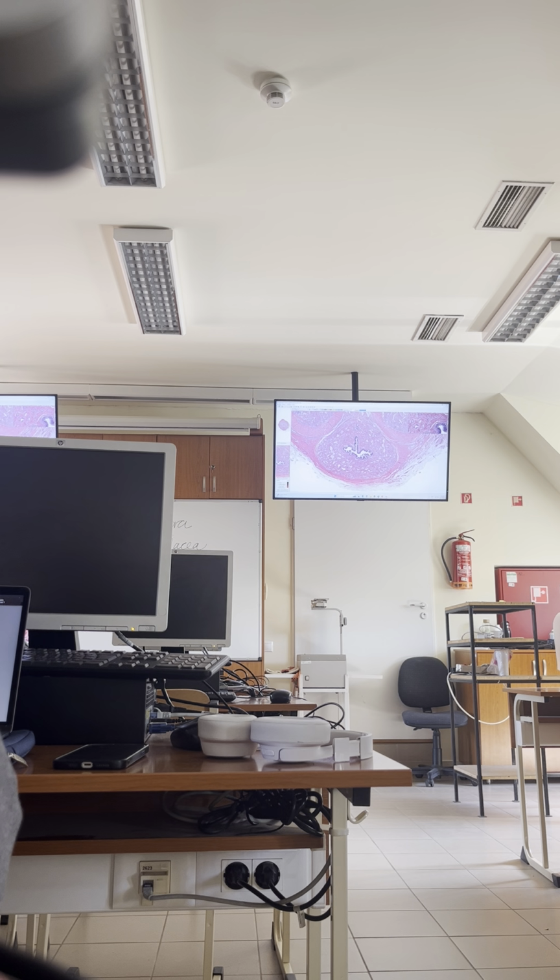I don't understand. Gland. Endothelium, like any blood vessels. Yeah.